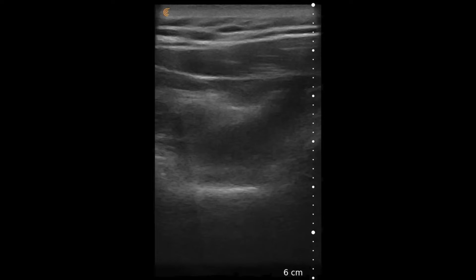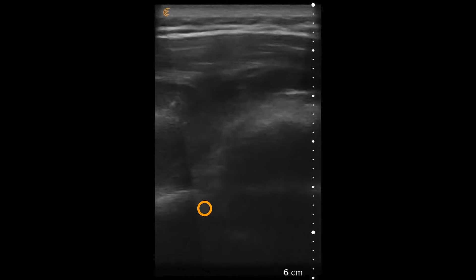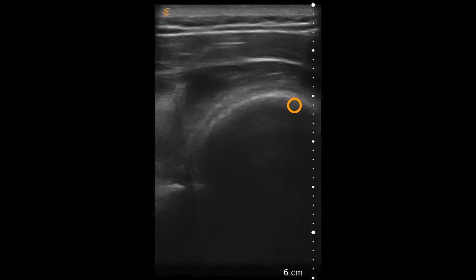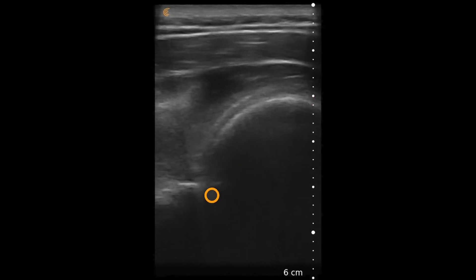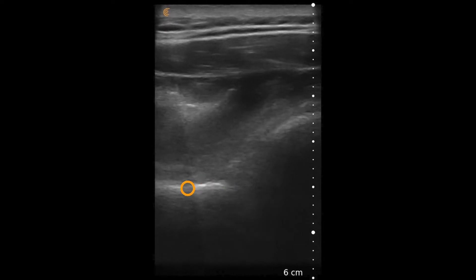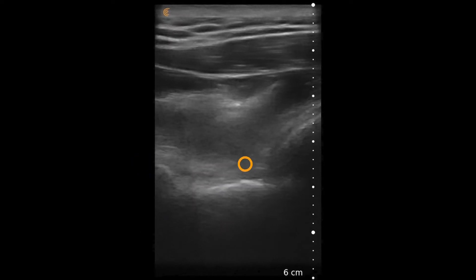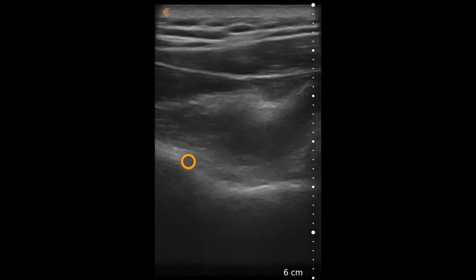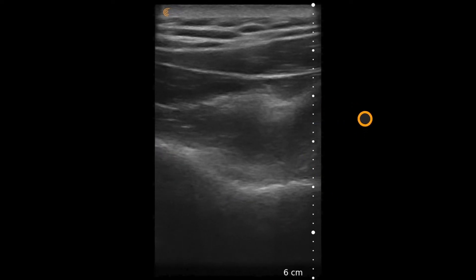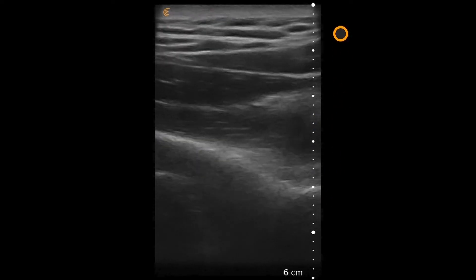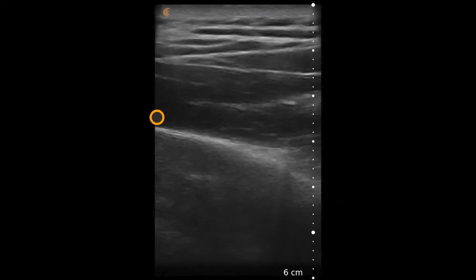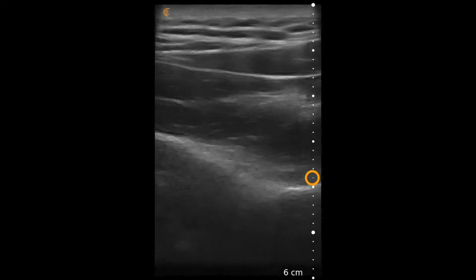In this video, we see the linear scanner on a musculoskeletal preset placed in the transverse plane on the posterior aspect of a shoulder in a patient who presented with trauma and shoulder pain. What's immediately obvious here is that the humeral head, compared to the glenoid and the scapular spine — which we'll see as the scanner moves more medially — is closer to the transducer than the scapular spine.